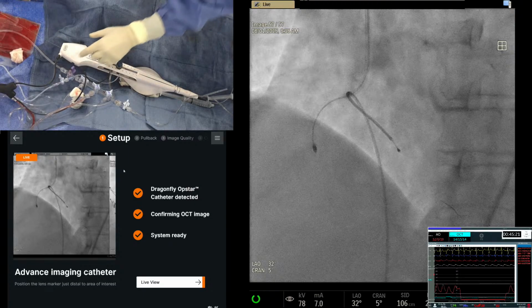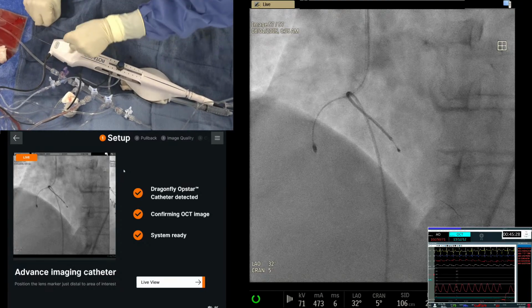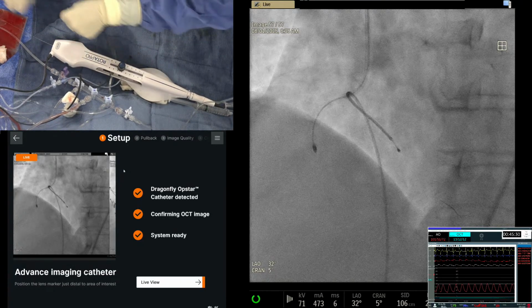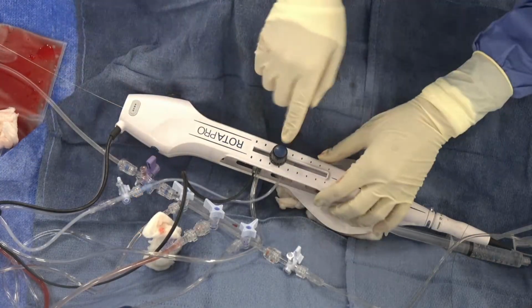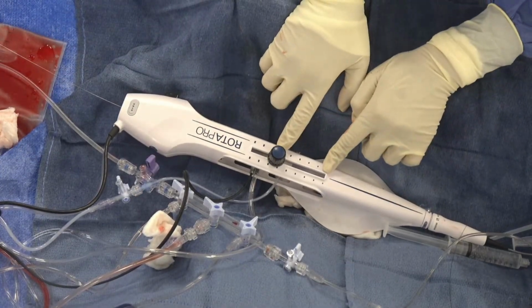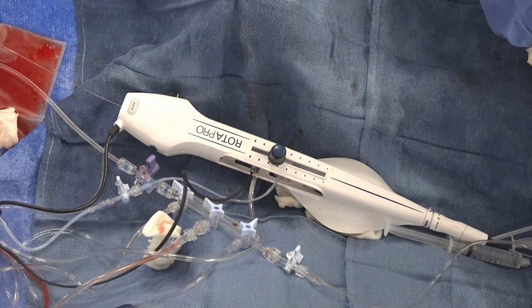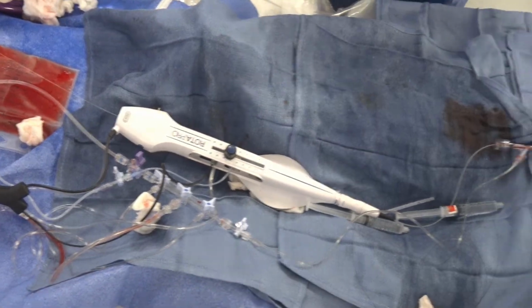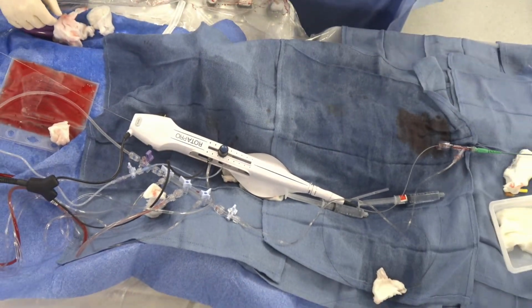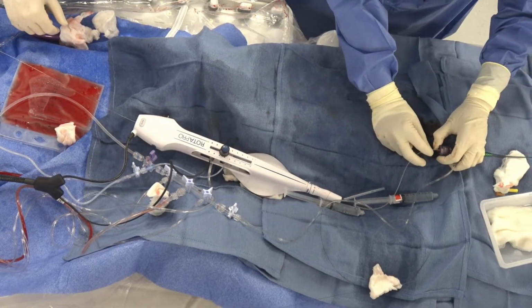So you see that? You do brake release, which means this wire that is held, the brake holds the wire tight so it's not moving backward and forward as I'm doing the rota. You understand? So he did brake release and the knob is tight. So this length is not changed. And then if you see, manually I went forward at the Y connector. This is rota not 101, 105. Yeah. Level 5. Show the Y connector that was missed before. So if you're at the Y connector, I keep moving.